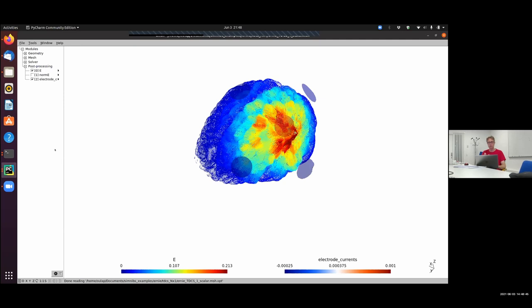Then you can mesh anything where you have a segmentation from, quite easily, to get a mesh which you can run in the simulations. It can then be non-human primates. It can also be a segmentation of your dog or whatever you want to simulate it on. So that will be quite flexible, but you unfortunately have to wait a bit until this will be available.